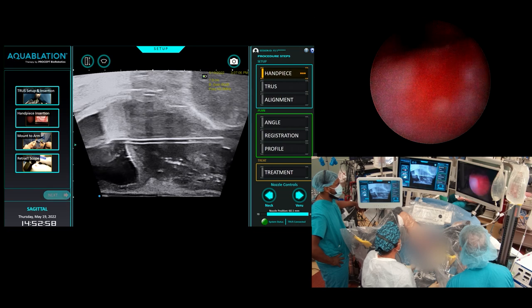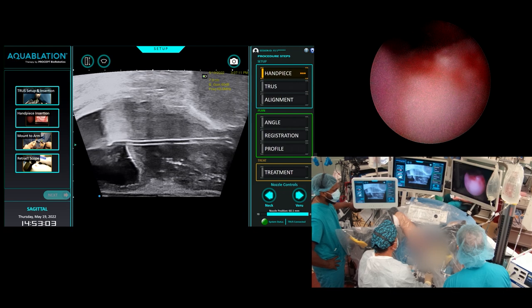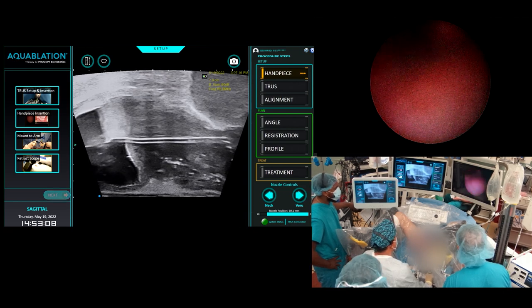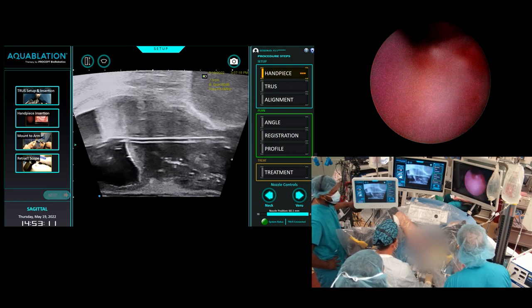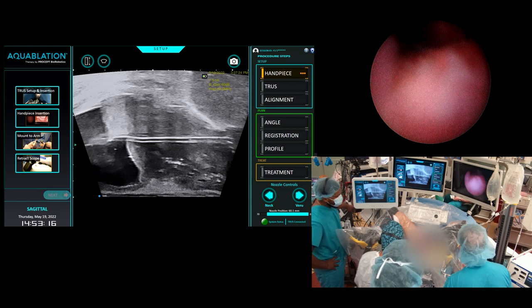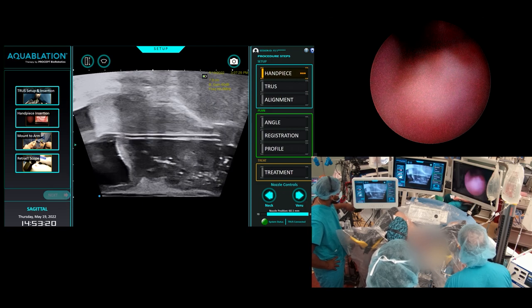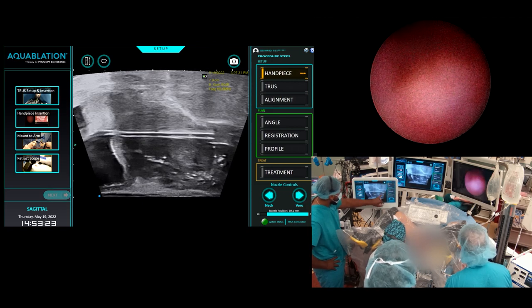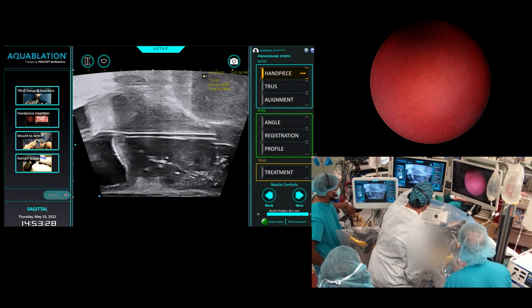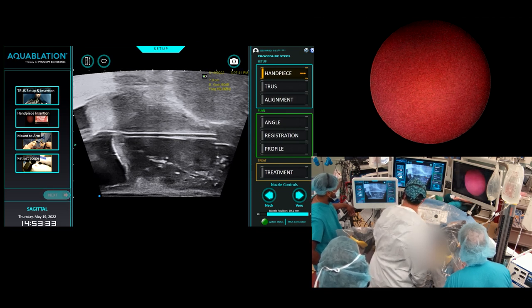I'm all the way back. Go all the way back, and once you're back, pull the handpiece — we'll see how much more we can go. Irrigation's on. Let me come back with ultrasound a little bit and see. Looks like urethral cliff here. I think it'll be one pass. There's my cliff right here for my prostate. There's my scope. I'm above it, right here. I'm going to leave it.